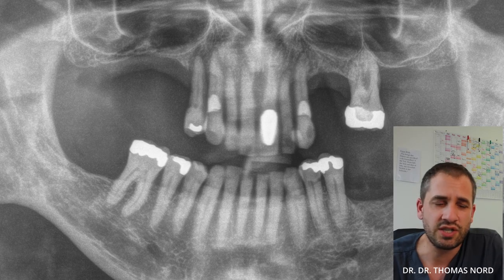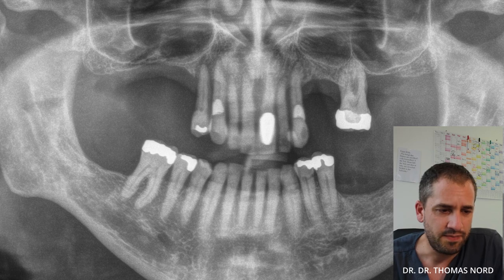Hi, everybody. I have a nice case I want to share with you. We can directly have a look into the panoramic x-ray before surgery. As you can see, the patient has a severe periodontal disease and we have to extract the teeth of the maxilla.